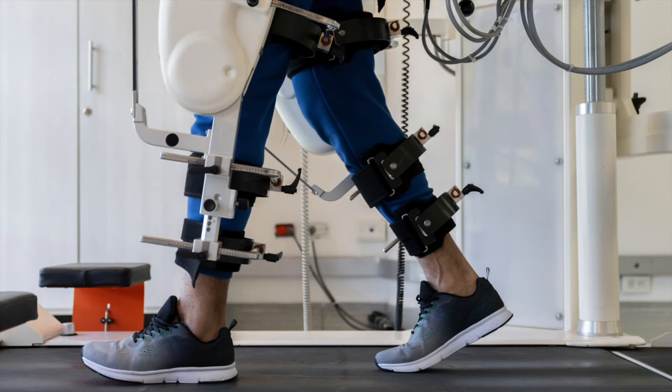Gait rehabilitation exoskeleton robots assist patients to complete walking in a normal gait and provide power for them. These exoskeletons are suitable for patients with abnormal gait trajectory or joint trajectory.